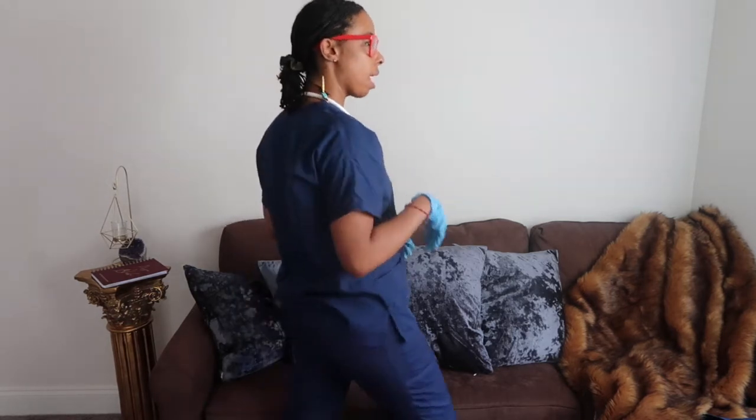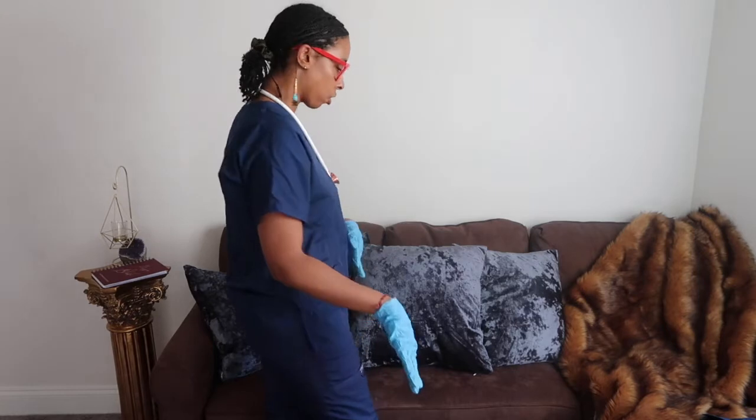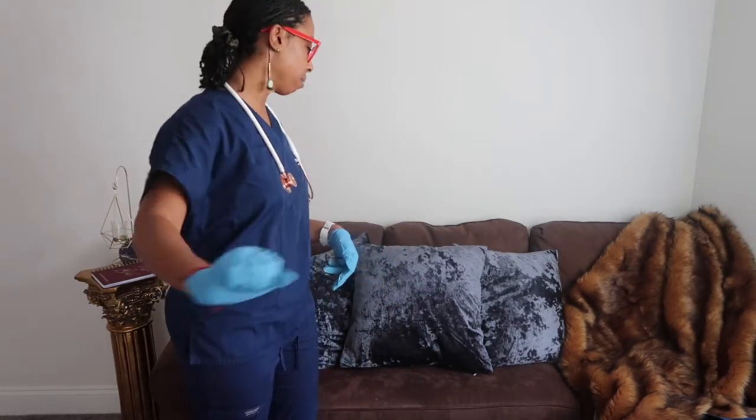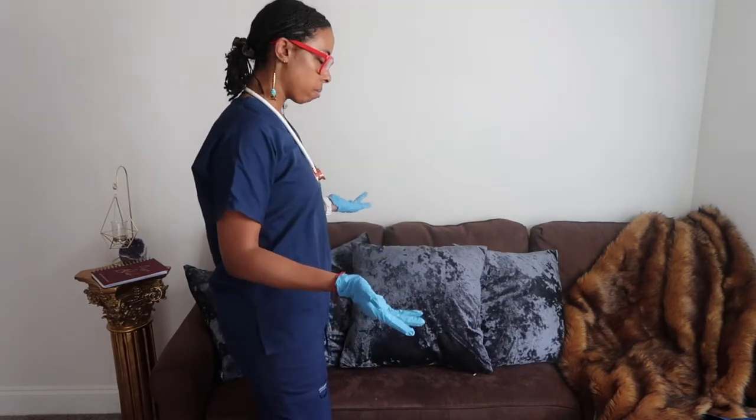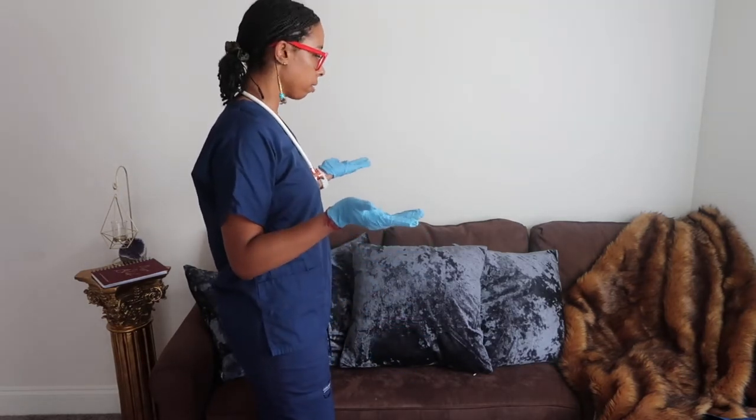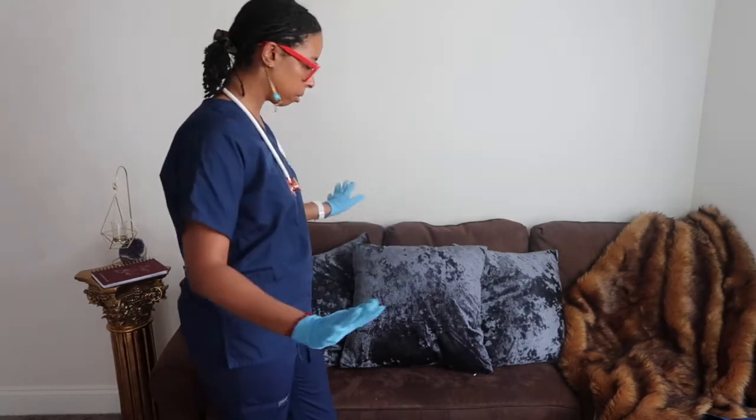Just make sure your bed is locked. Make sure you have all your equipment. Make sure you have your call light within reach. I'm going to pull the drape from behind me to make sure you have some privacy. I'm going to bring up your bed to a comfortable working level.